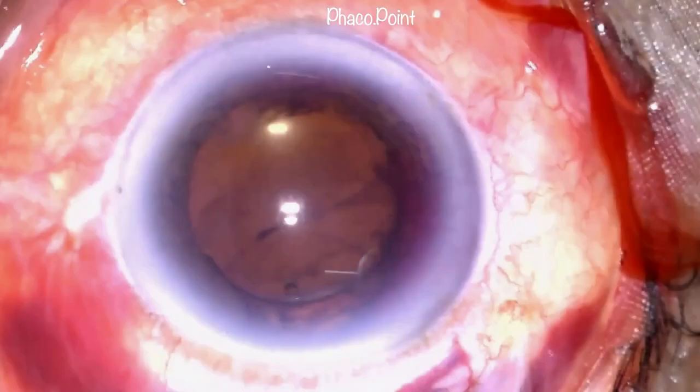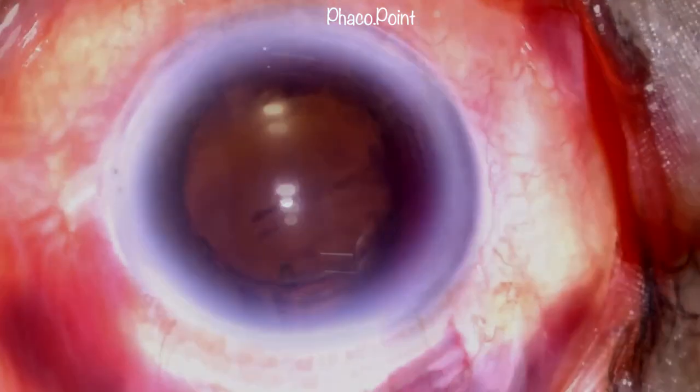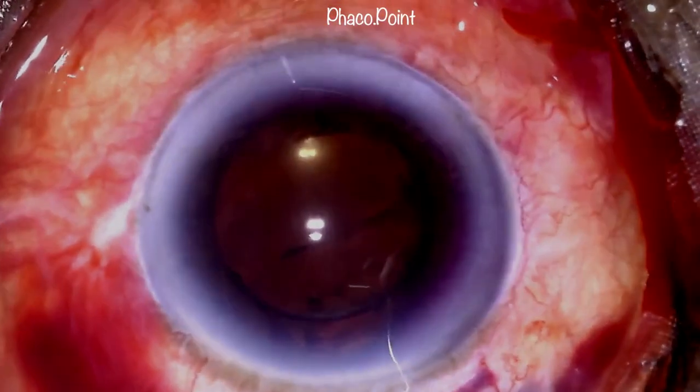This patient, who had undergone a manual SICS cataract surgery and had a rigid IOL implanted in the capsular bag, sustained a blunt injury in the early post-operative period and presented the next day with an appearance like this. There are blood clots in the anterior chamber, the superior iris seems to be missing, and there is prolapsed vitreous in the anterior chamber superiorly.